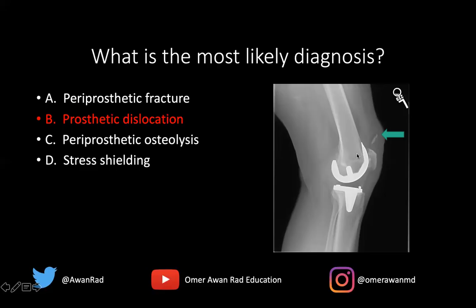I also want to point your attention to the relative lucency along the anterior femur — this is normal stress shielding. It is a normal response to the altered weight-bearing mechanics that occur with a total knee arthroplasty. Most of the weight-bearing occurs along the posterior aspect of the joint and femur, which is why you get sclerosis posteriorly and relative radiolucency along the anterior femoral cortex.